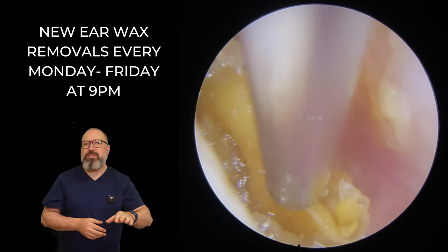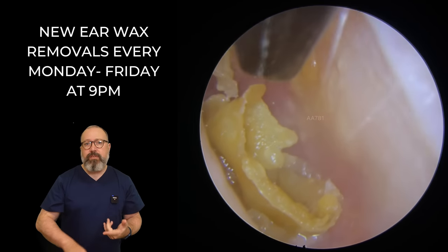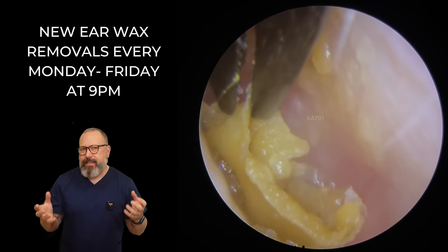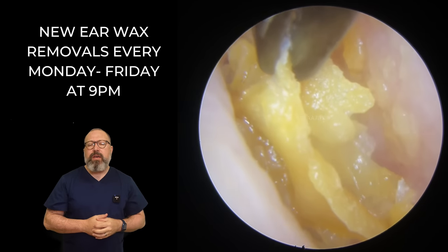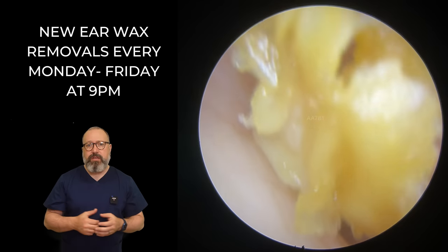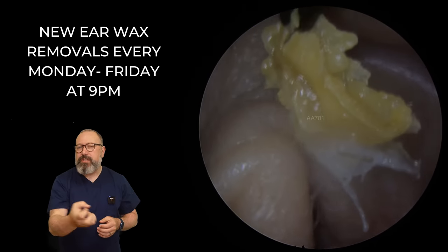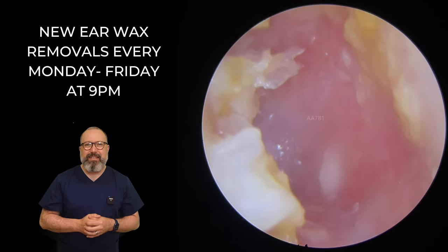You can see all the way around the outside edge. The patient has used a variety of drops in here — olive oil, bicarb, O-Tex — everything but the kitchen sink has gone into this ear canal. And what's happened is you can see it's a very, very irritated ear canal — it's got that sort of mottled pink and white appearance to it. We've got the crocodile forceps in here just because it is so tough — great for pulling these kind of plugs out. Out this comes. I thought we were going to lose it there — it's just starting to lose its grip a little bit. But you can see where it was attached to that fresher skin underneath as well.